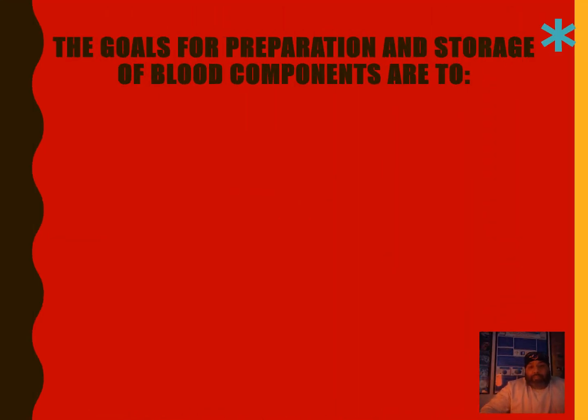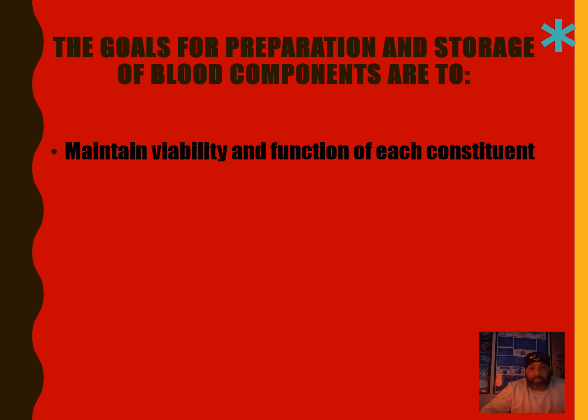Now, the goals for preparation and storage of blood components are also several and important. Generally, it's important that there's maintenance of the viability and function of each constituent. What this means is, let's say, for example, your general red blood cell component has a certain percentage of other components.